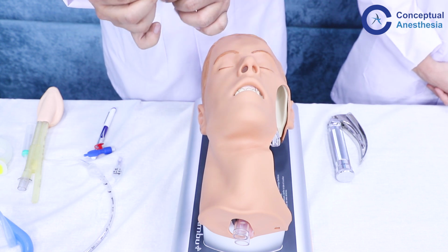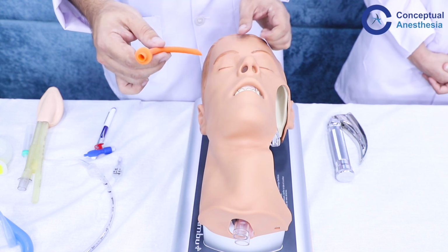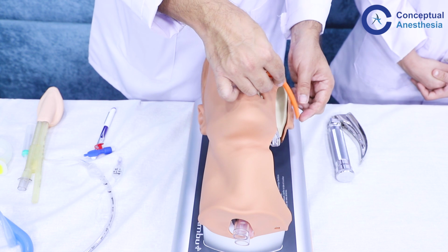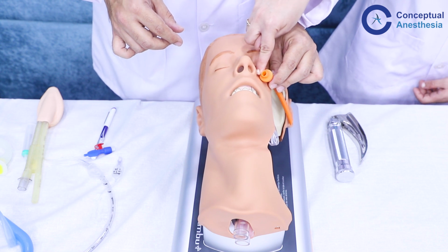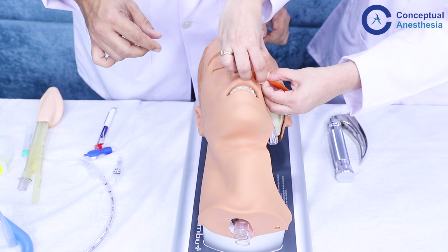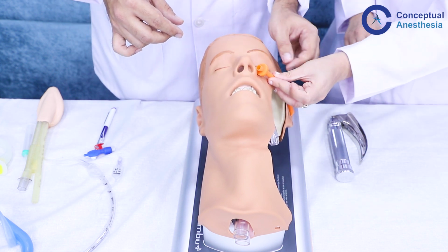To measure the size of the nasopharyngeal airway to be used in this patient, the first thing we do is place the tip of the airway at the tragus of the ear and we place the flange at the tip of the nose. Okay, so next to the nares. Now we can adjust this flange accordingly to what will be the correct size. So this flange is adjustable.